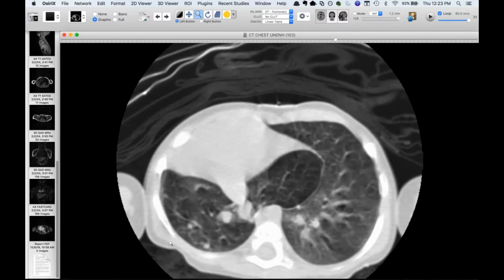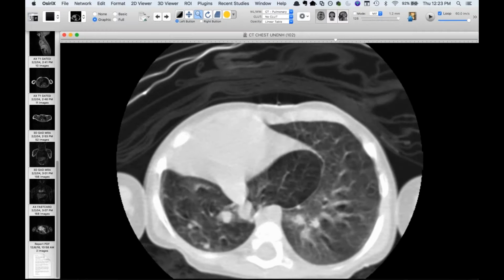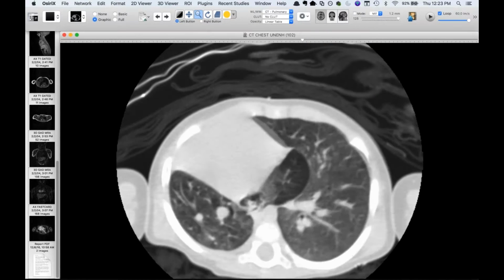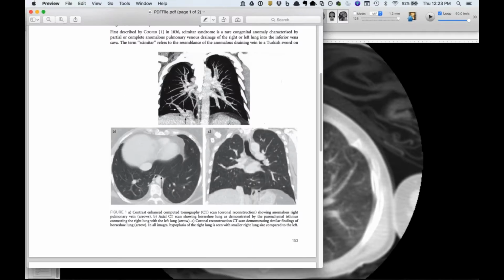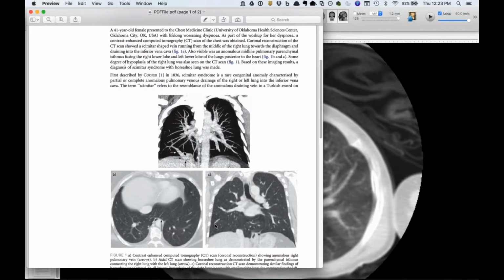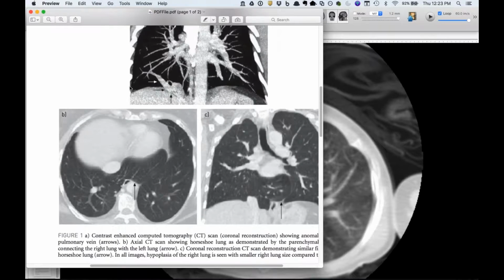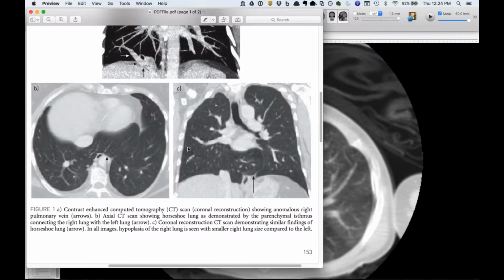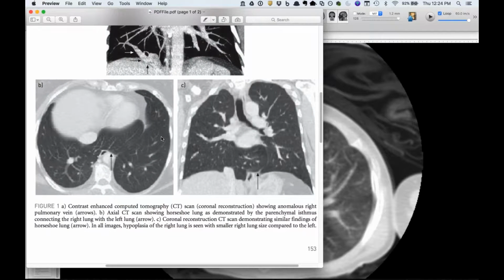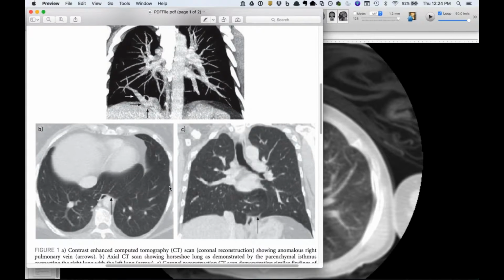So I had a case that looks very much like this, except not so much motion artifact, that I sent to Jeff today. This is called horseshoe, but I think it should be horseshoe in quotation marks because, in the analog, the horseshoe kidney, there's actual fusion of parenchyma across the midline, and those kids have a number of bad disease. And true horseshoe lung also is not compatible with life. The kids that have real horseshoe lung, that's fusion of parenchyma, really have a lot of congenital abnormalities and they don't survive. So this is really pseudo horseshoe because the lungs are still separated. There's no parenchymal fusion. That's kind of what I was thinking too.